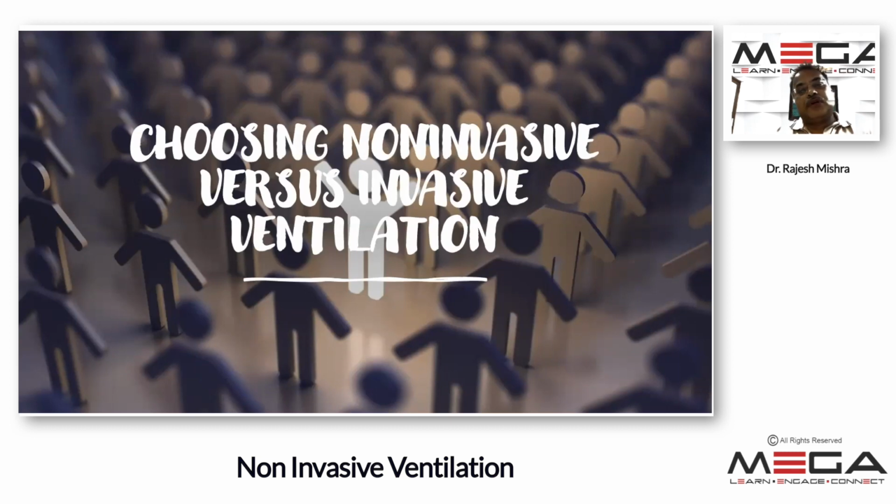If you just put it on and leave the patient, it may be possible that your patient will worsen or arrest on NIV, and if the patient arrests on NIV, you will not get a chance to intubate, and most of the time this patient dies because of the hypoxic arrest.